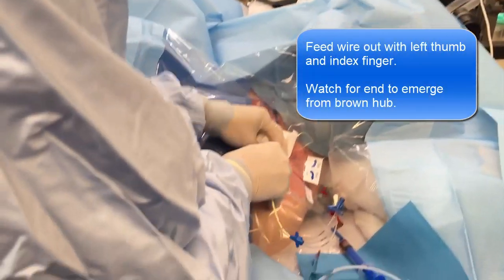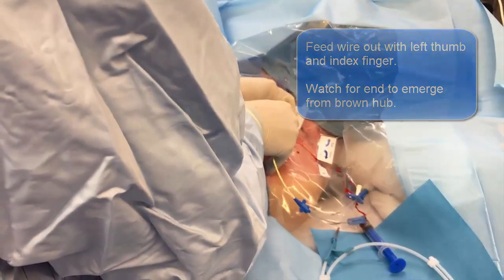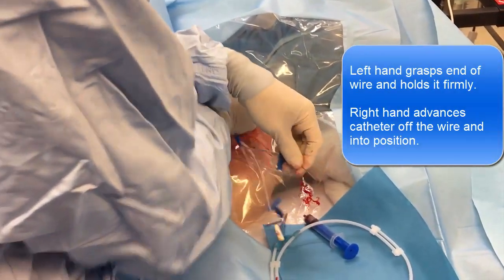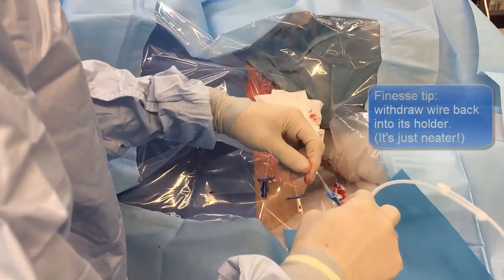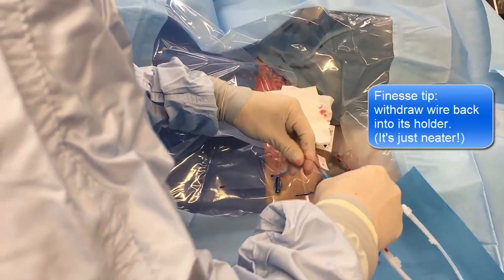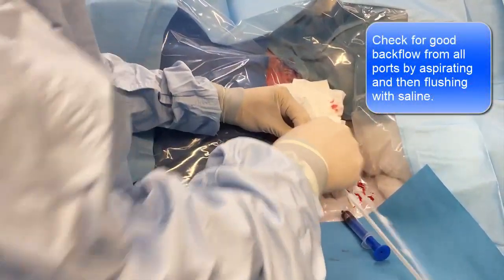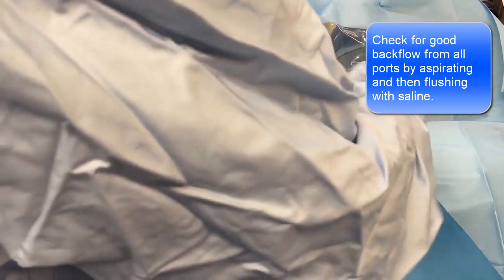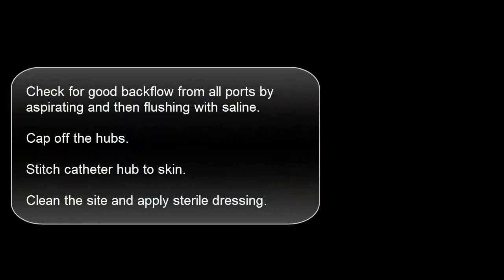The risk of a pneumothorax is low because I never point the needle down towards the lung. And when you start going to the procedure and you start scrubbing, you'll see that the lung is actually a long way away. So you see how fast a subclavian line can be placed. This is just to flush — so it's a nice backflow.